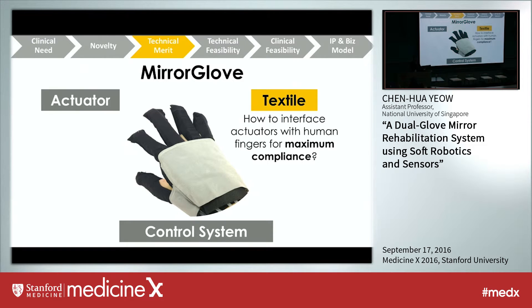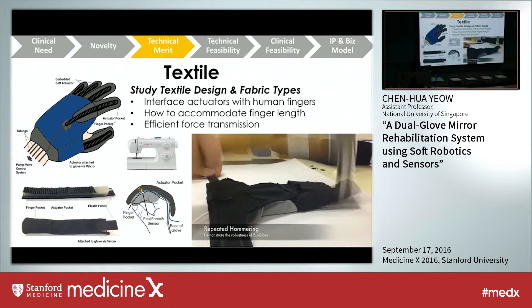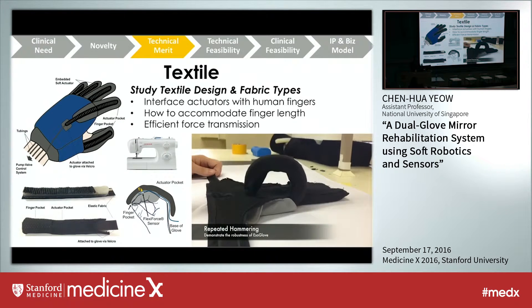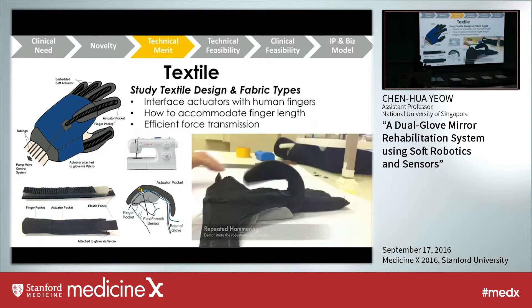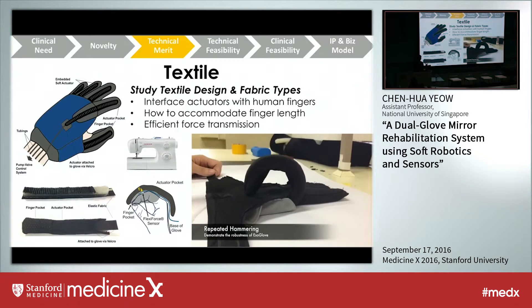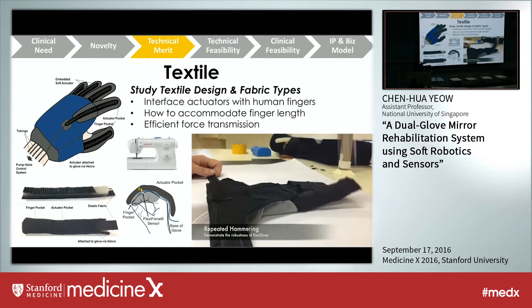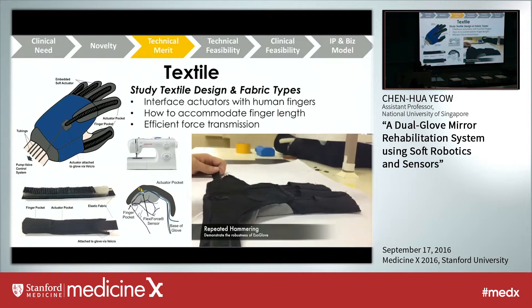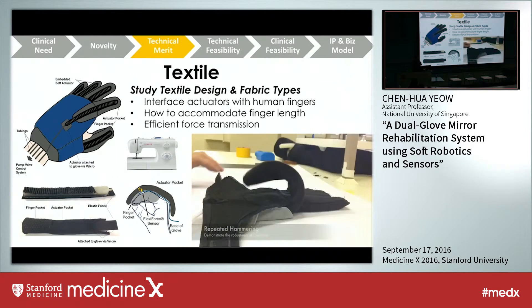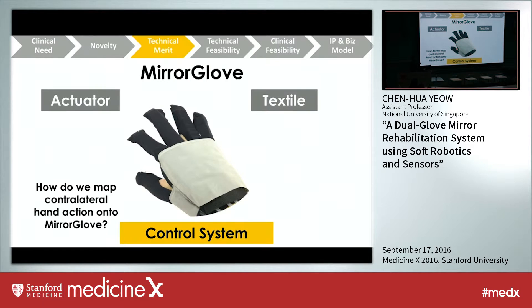Regarding the textile aspect: since this is a soft robotic glove, we need to interface the soft actuators with the human finger for maximal compliance. The engineers in my lab are not only good at electronics and mechanical design, but also very good at sewing. We did extensive textile design studies and tested different fabrics. As you can see, we designed actuator pockets to embed the soft actuators, and finger pockets to accommodate different finger lengths and ease of use for stroke patients. The combination of fabric and silicone rubber creates a very robust robotic glove — it can withstand repeated hammering, unlike traditional exoskeletons which would fail after just one impact.